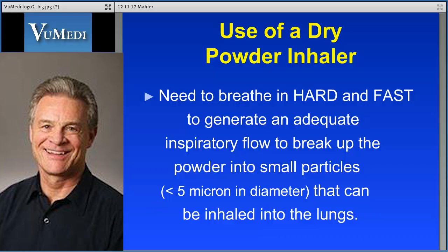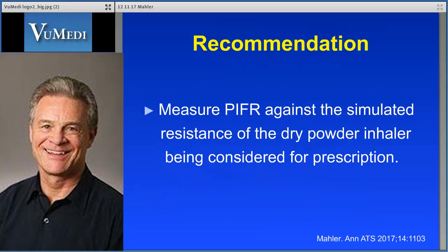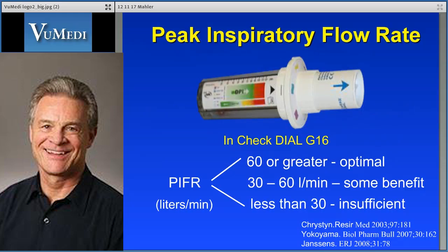The recommendation is to measure the peak inspiratory flow rate against the simulated resistance of the dry powder inhaler being considered for prescription. Peak inspiratory flow rate can be measured by different devices. Shown here is one of these devices called the InCheck Dial G16.